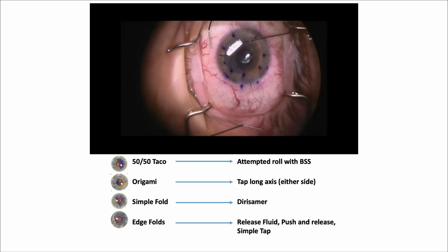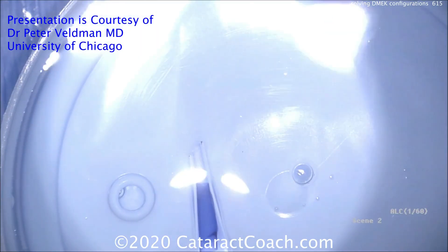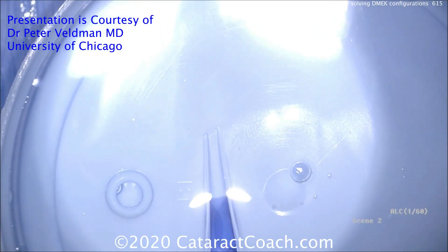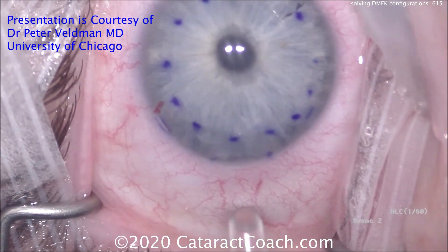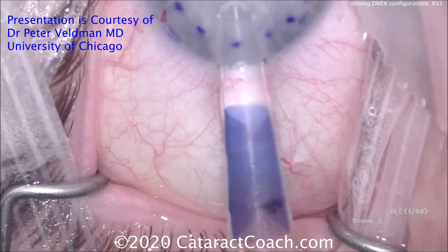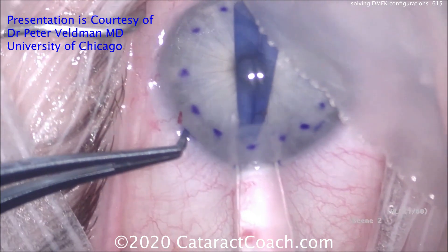These techniques — taco to origami to fold to edge fold — can all be combined. A great trick from Dr. Veldman is starting with a great configuration when loading the graft. Drawing balanced salt solution back and pushing the graft down repeatedly in the Jones tube achieves the desired configuration — a beautiful double fold. Starting the case with the graft already in correct orientation with a double scroll makes the procedure far more efficient, allowing experienced corneal surgeons to complete the whole procedure in just a few minutes.